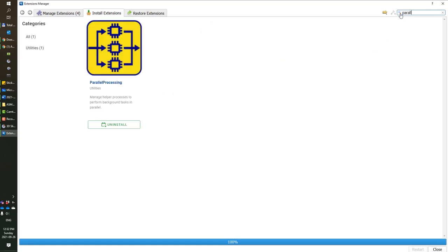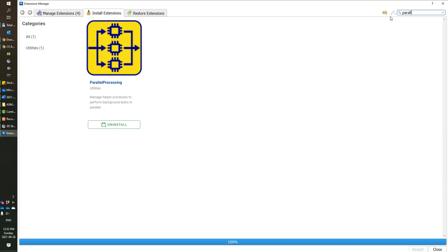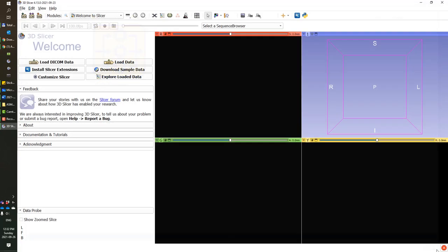In addition, search for parallel processing extension and install that too. This will allow faster predictions on the images.